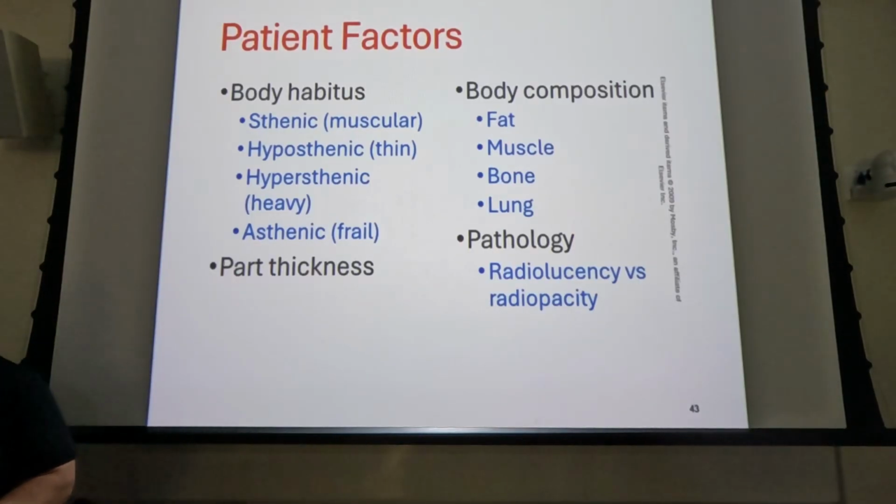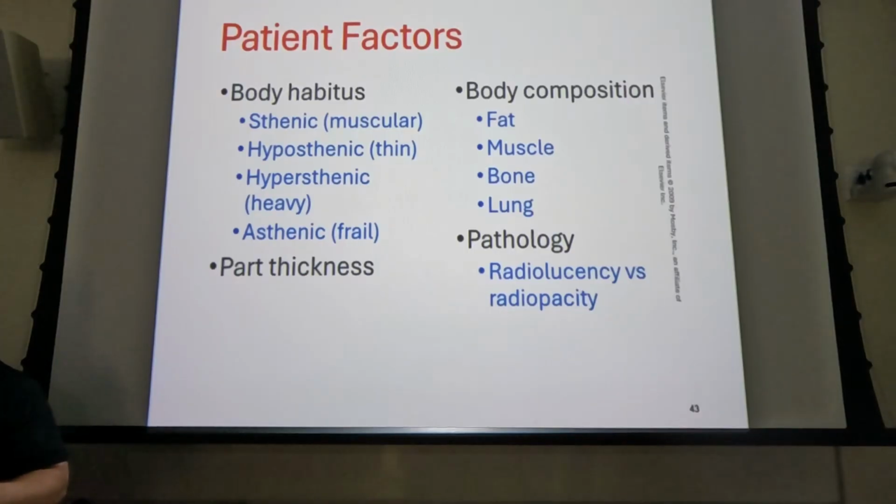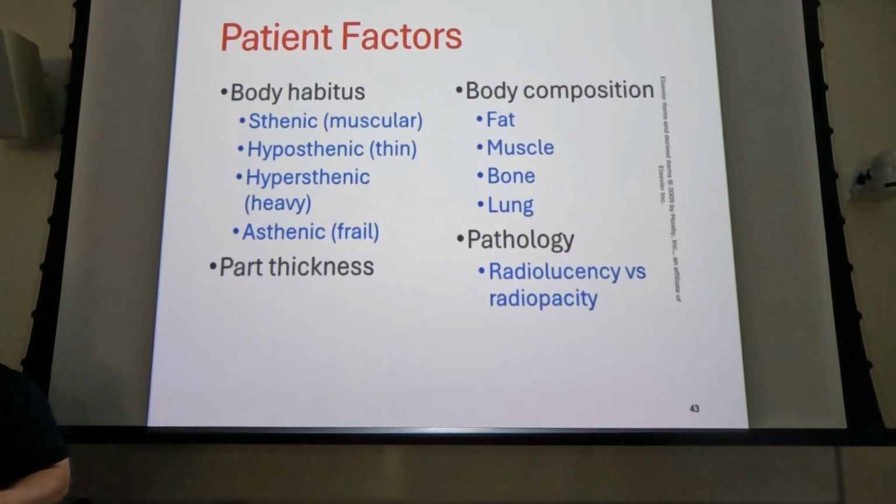But barium, you just can't see through barium. It's just dense. But the atomic numbers are almost identical. So what's the difference? It's the quantity in suspension, right? The barium is much more dense. So it's not just the atomic number or the effective atomic number, and that's what you'll see these referred to as, effective atomic number, or Z effective, or ZEF number. What that means is kind of the average atomic number of all the mineralization in bone would be its ZEF number.